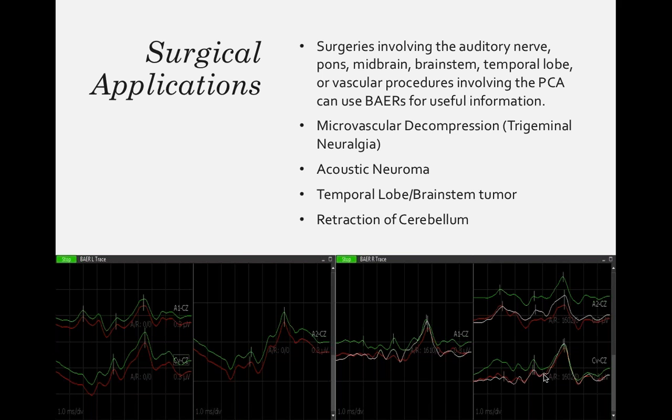So using our ABRs, our BAERs, for these specific types of surgical procedures or steps inside of a surgical procedure is useful information.